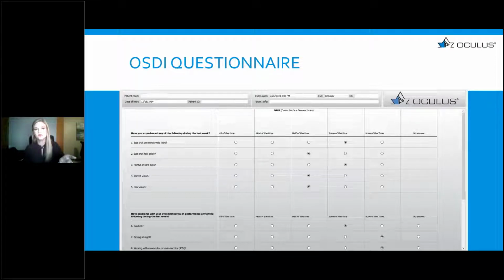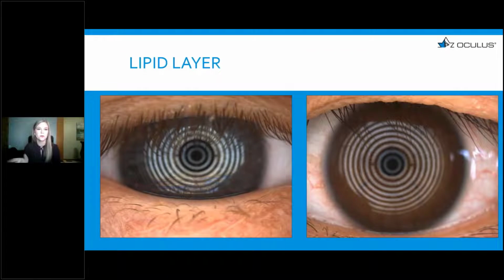The higher the score, the worse the symptoms. This is really, really important to do. This only takes about a minute, but this helps a lot with your patients in understanding their dry eye throughout the year or throughout your treatments. A lot of times patients don't remember how bad their eyes were at the beginning of treatment. It's kind of like when you change your patients into a new multifocal power and they're seeing awesome. And then they say, well, I feel like I saw better in my old ones, right? And then you have them switch back and they really don't see better in their old ones. So this is a good way to know, okay, this is today. This is what their score was, and this is how they were feeling. Because a lot of times patients feel like they're not getting better or they feel about the same, but really there's huge improvement. So I like to really just show them and quantify that for them.